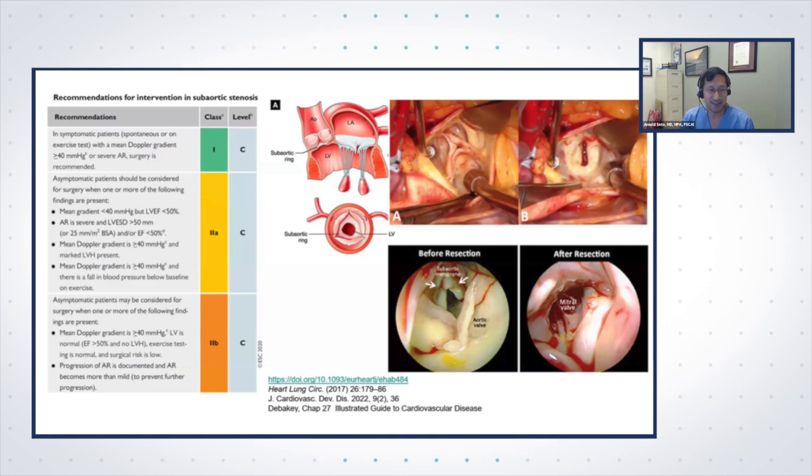I've had one case of this where I sent it to the surgeons, and they were quite disappointed that we suspected severe AS, and they were not prepared to do a resection. They asked me, is there any way you could have known beforehand from the waveform or anything? And I thought, is there any difference in that waveform? And I really couldn't say that there was.